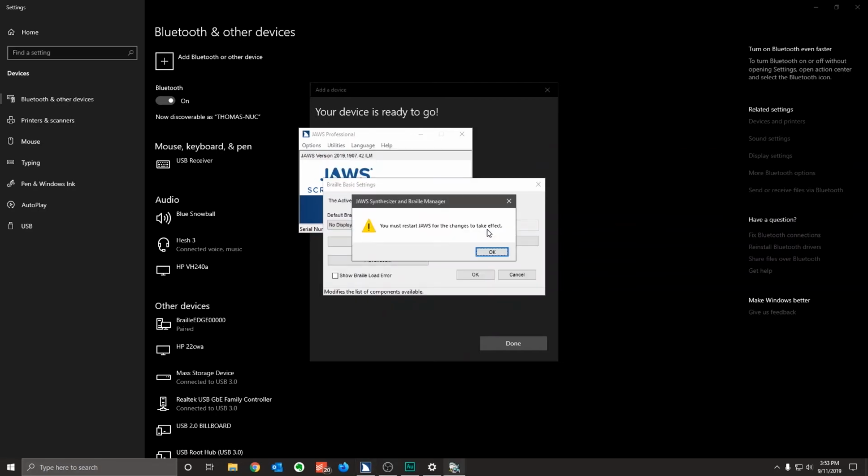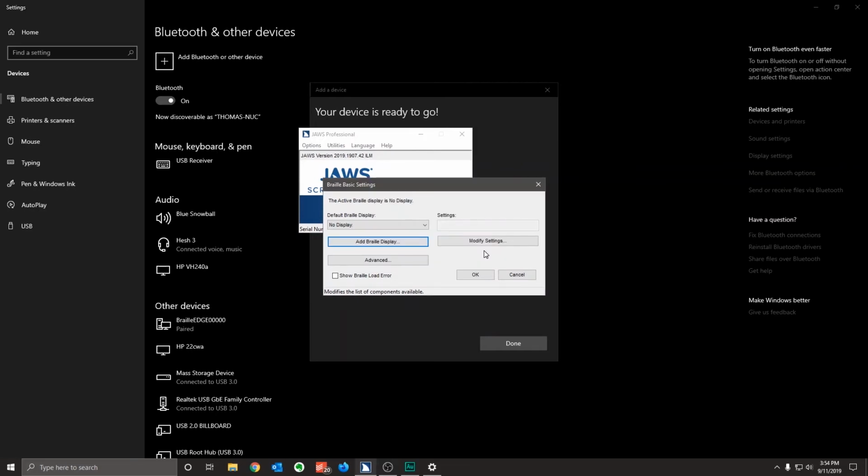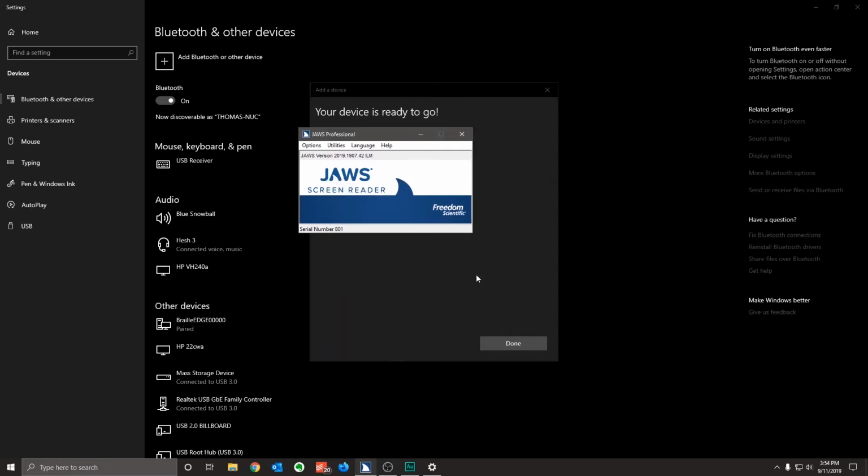JAWS Synthesizer and Braille Manager dialog. OK button. JAWS will need to restart for the changes to take effect. I'll press OK to close the open dialog boxes. JAWS Professional. And then I'll go ahead and close JAWS.